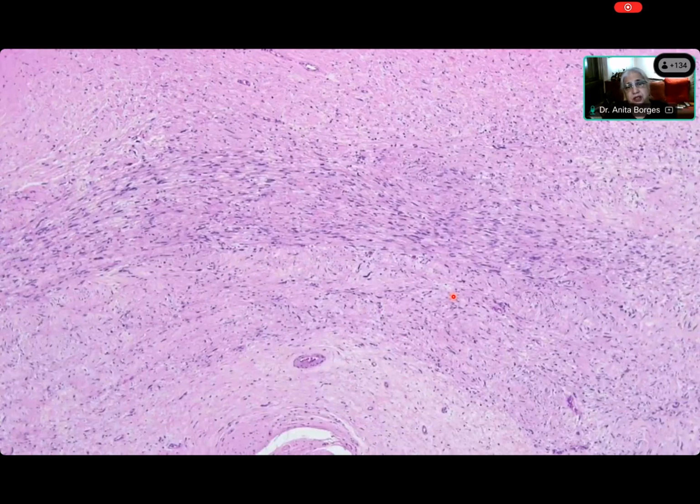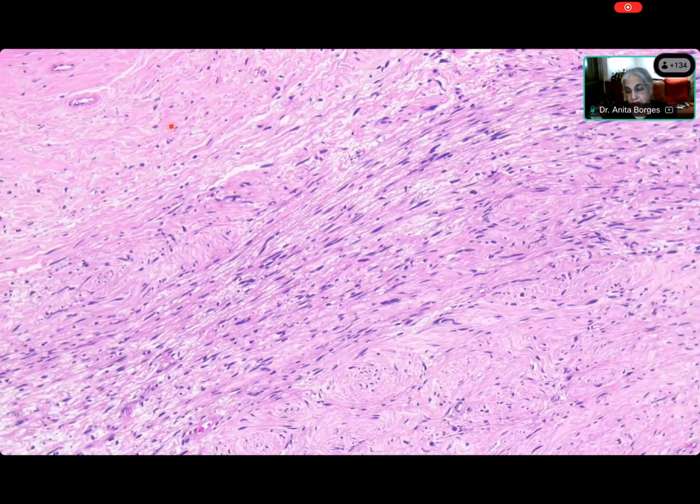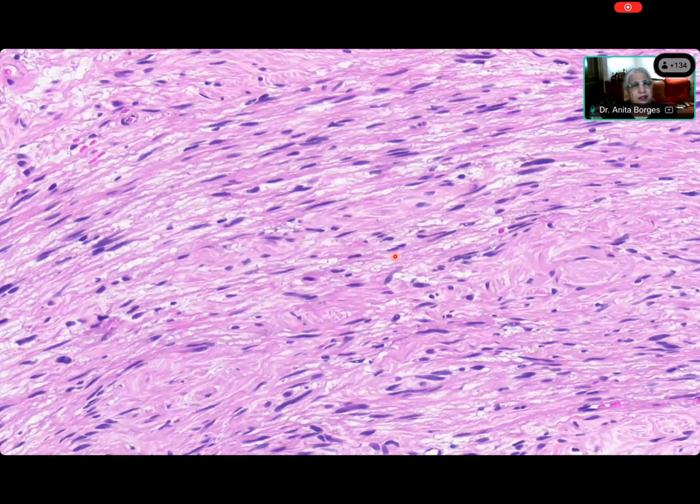And here at the periphery, you are seeing this collagen, which is a lot, and you're seeing fascicles. Okay, so there are the fascicles, and look at the amount of collagen that there is over here. Very good. And if you look carefully, you feel that maybe there are some entrapped nerve bundles, but I cannot swear to that, and I don't have an S100 protein to show you whether that is there or not.